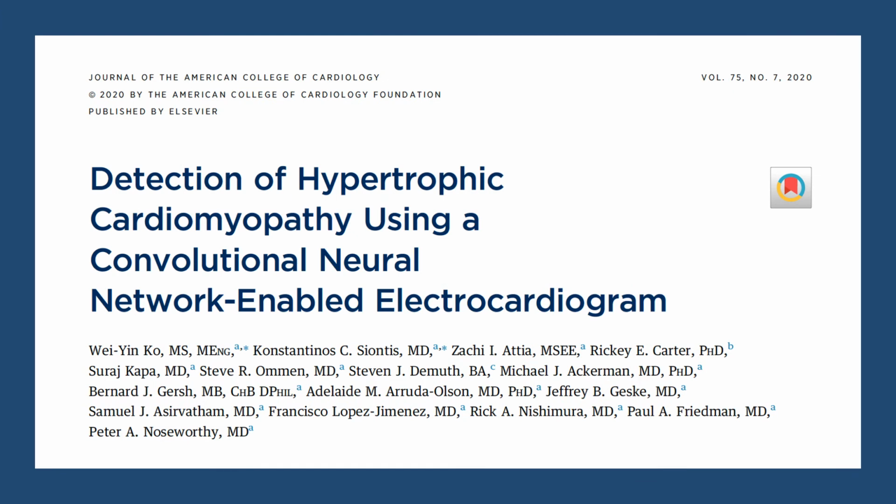Artificial intelligence will play a major role in medicine. This study sought to develop an artificial intelligence approach for the detection of HCM based on 12-lead ECG. A convolutional neural network was trained and validated using digital 12-lead ECG from 2,448 patients with a verified HCM diagnosis and more than 51,000 non-HCM age and sex-matched controlled subjects.